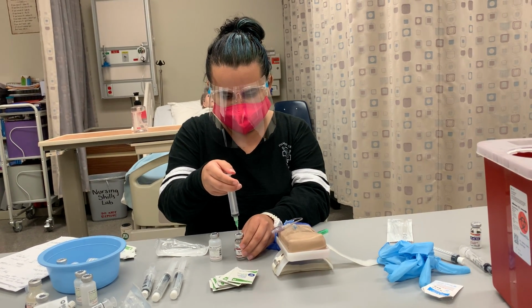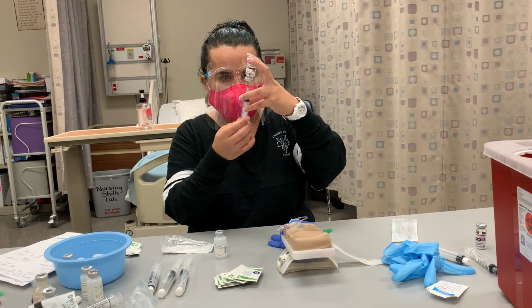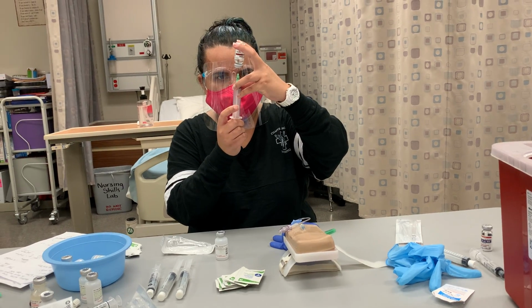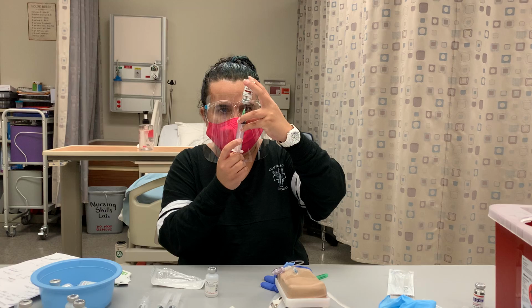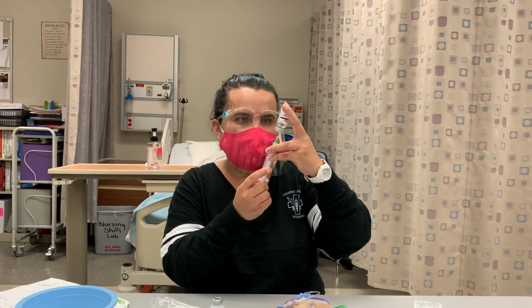Last time. Okay. Now I'm going to be retracting 0.8 mLs of morphine. It's hard because they've been so used, I'm getting some tension.